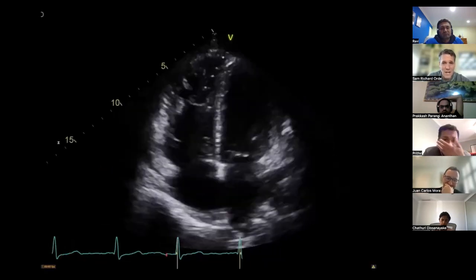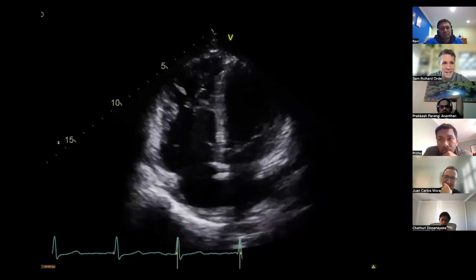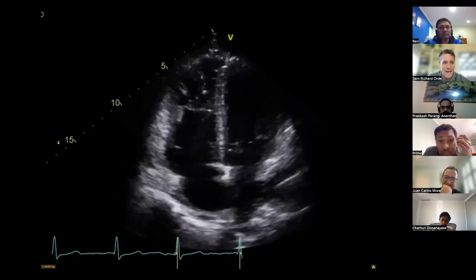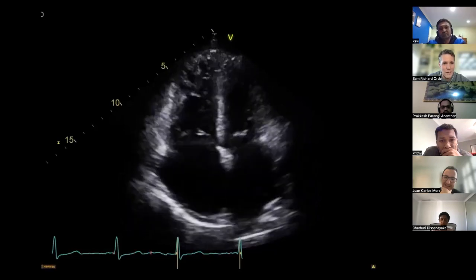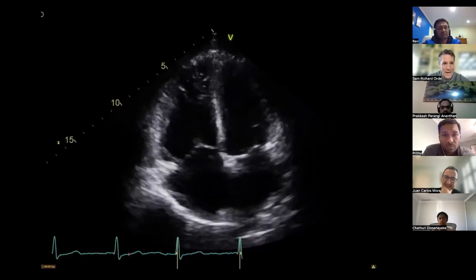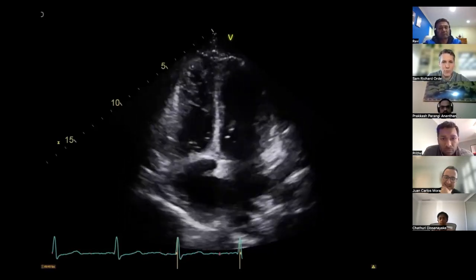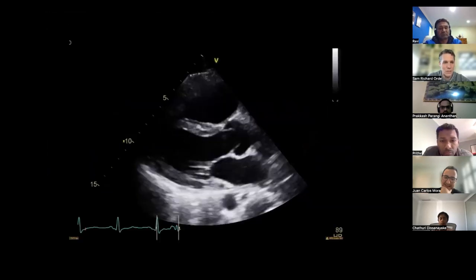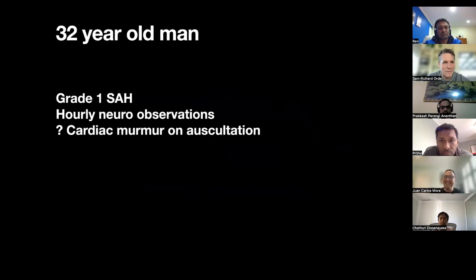That's fantastic. I think we've got unexplained right ventricle overload here, and absolutely, as you surmise, we've got to therefore think about ASDs. So you did really well in that, and it was wonderful watching you squirm there. Thank you very much indeed. I enjoyed that very much.